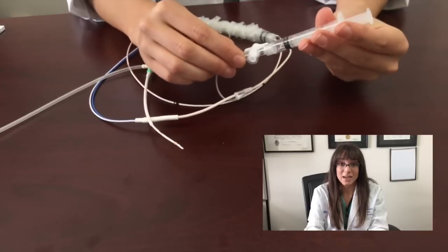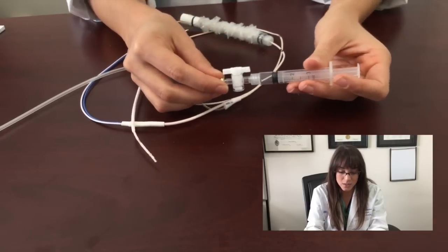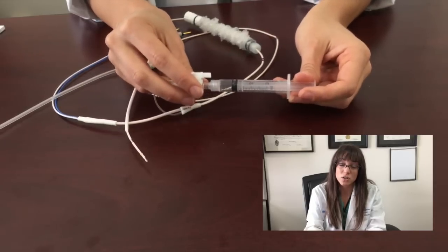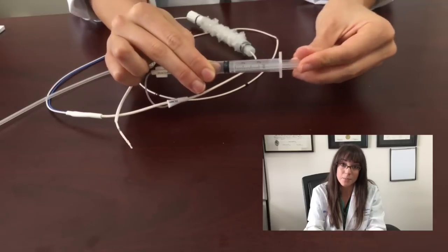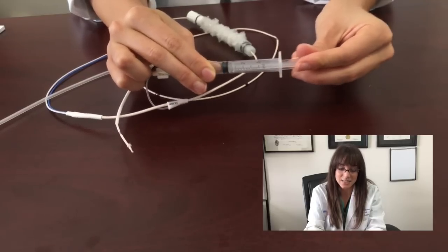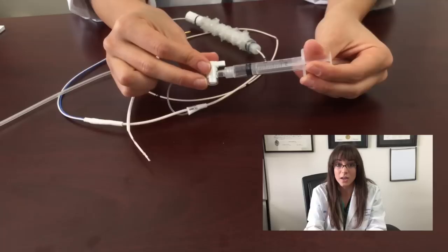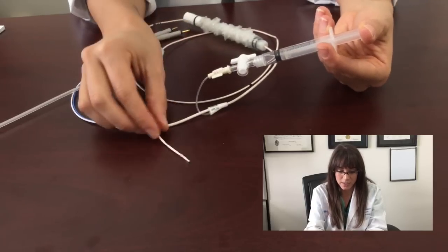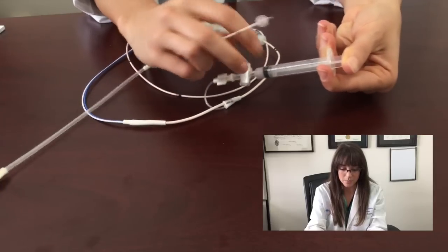Now my hands here are non-sterile. This step is important because this syringe is the syringe that comes with the kit. It is important because it actually stops at 0.75 cc's, so this way you don't over-inflate the pacemaker wire and ruin it. The non-sterile assistant is going to inflate the pacemaker wire with air and lock it in place.